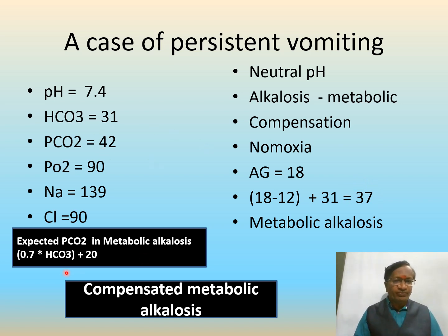We have a PCO2 of 42. Expected PCO2 in metabolic alkalosis can also be calculated like this. So an additional metabolic alkalosis if it is more than 26. This is also clear. Expected PCO2 in metabolic alkalosis. So it is a case of metabolic alkalosis which is compensated.